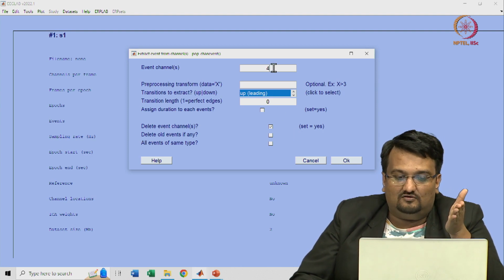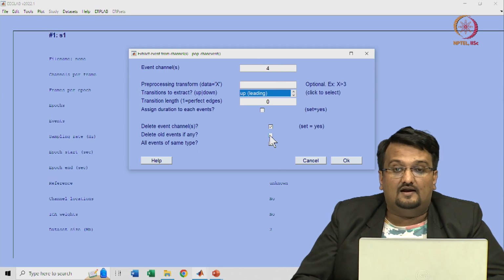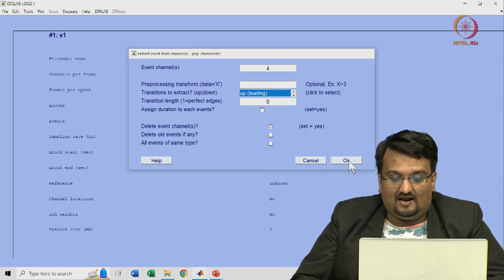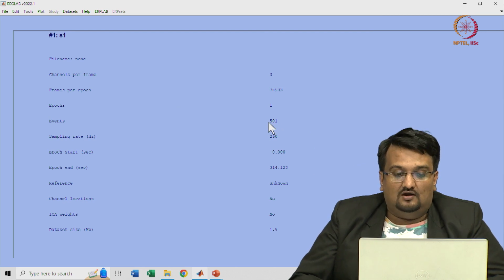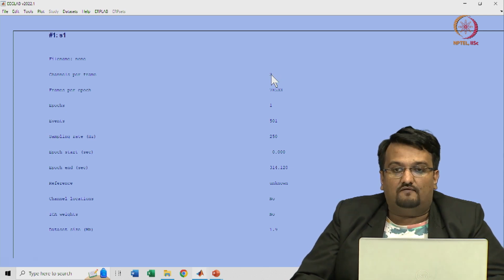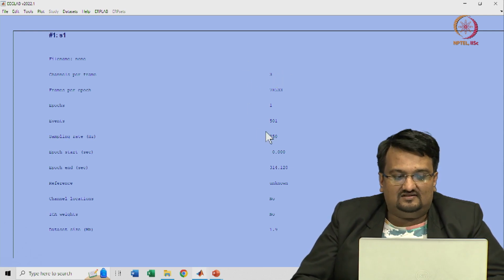So now I am going to take events from channel number 4, and as I mentioned, don't forget to uncheck this option, otherwise your previously added deviant events will be lost. Now I will extract the events from one more channel, and you see this 100 has become 500 events, and the number of channels has become 3 from 5. So the data we imported consisted of 3 data channels and 2 event channels, and we have successfully taken the 2 event channels and generated the events. The next step is to check the data.